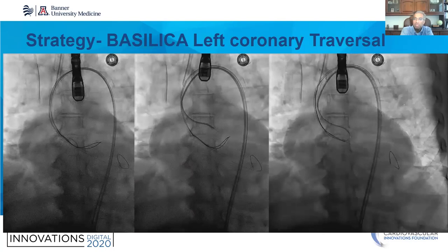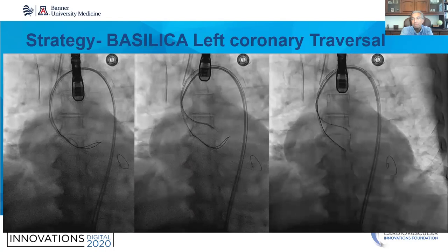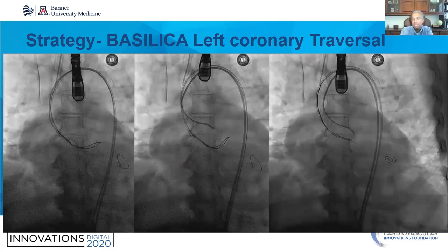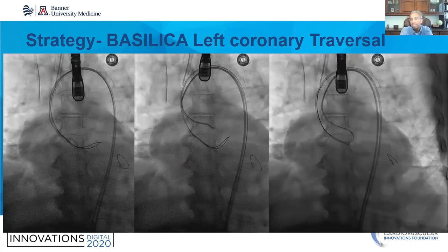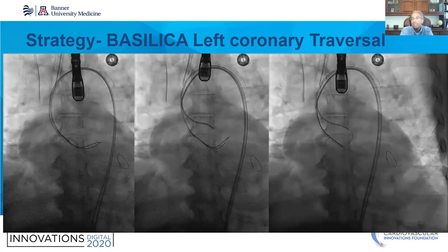Once we accomplish this, we then back the piggyback catheter back, and expose the wire at roughly half its catheter length, namely at about 150 centimeters, and at the hub of the sheath in the groin, denude it and create the flying V.